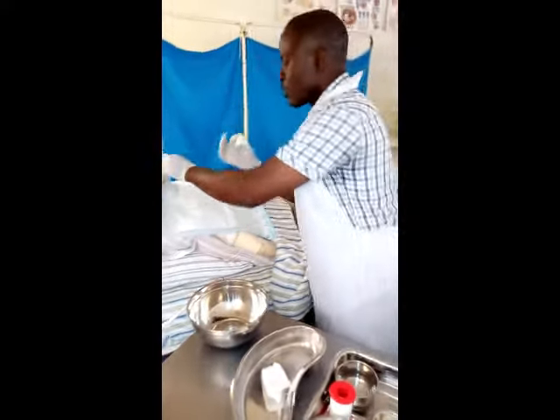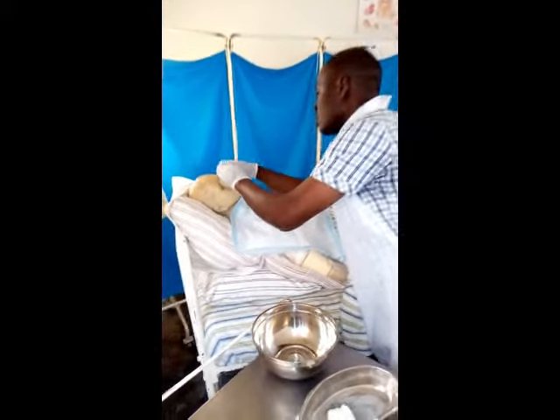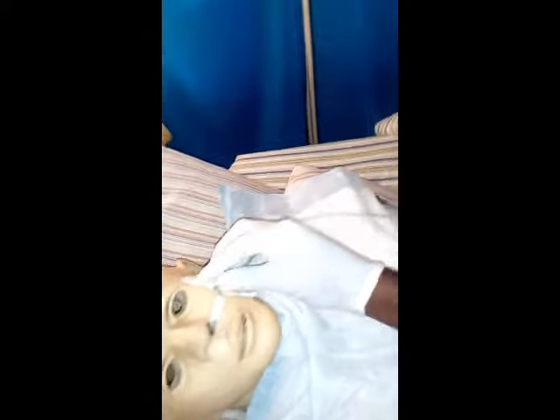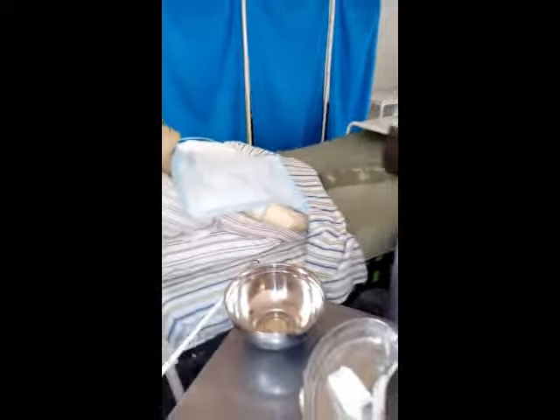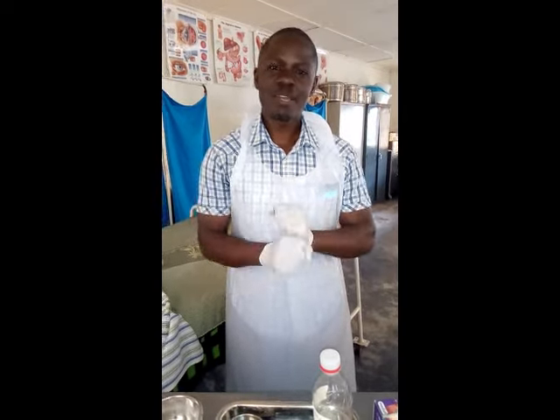Then the tube can be secured on this side because that's where it's easy. You can give Mrs. Mwape IEC and emphasize not pulling the tube. Then you can prepare for your feeds. Thank you very much for watching and hope you have a pleasant day. Thank you very much.